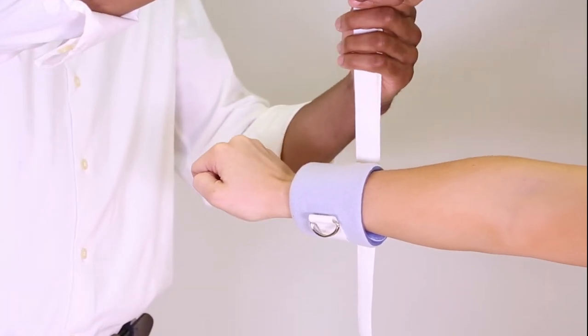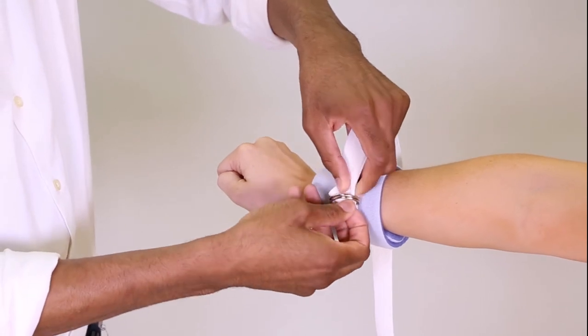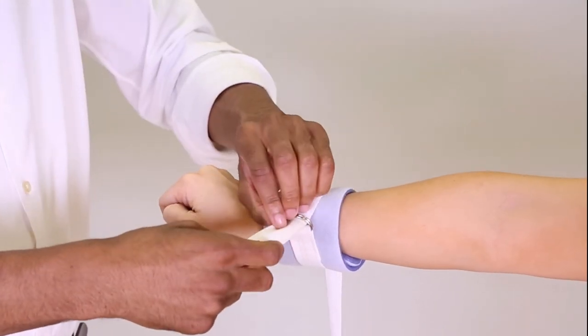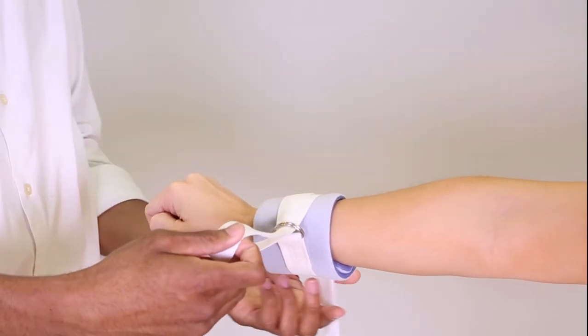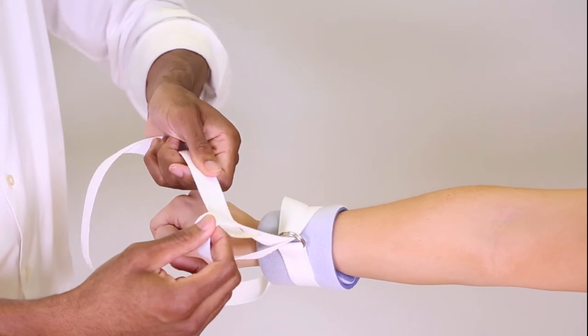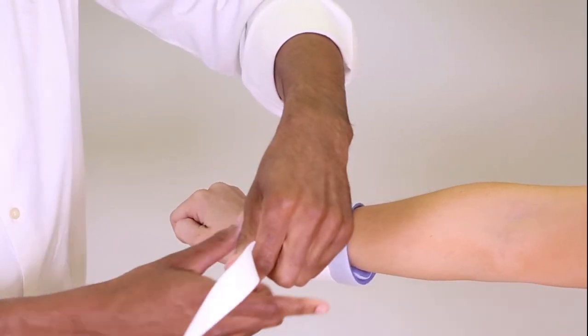Fold the strap, creating a loop. Feed the loop through both D-rings. Hold the loop in place. Take the end of the strap and feed it through the loop and pull.